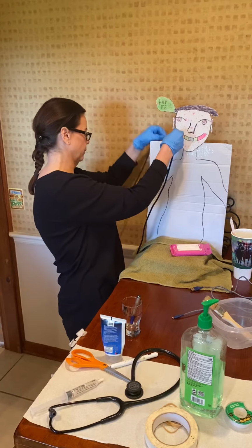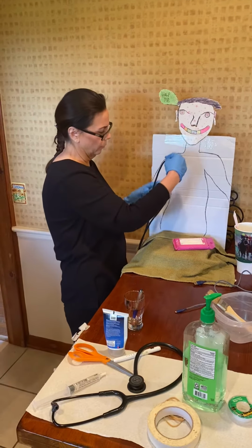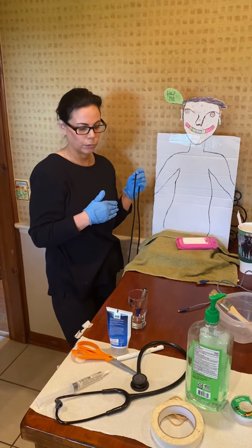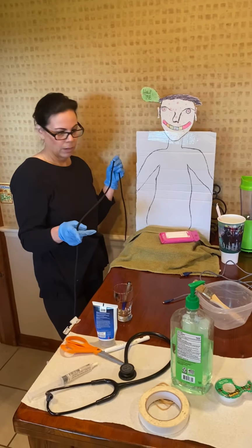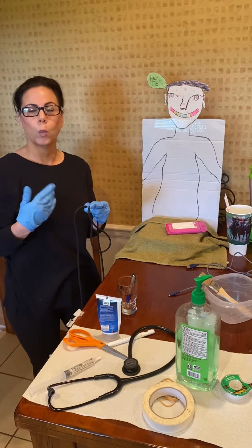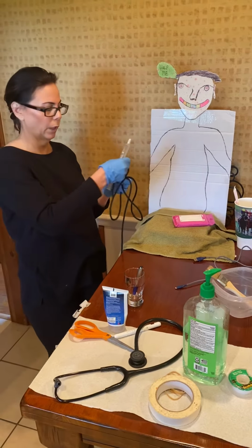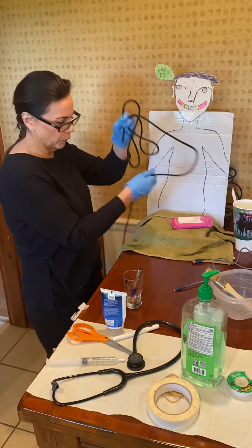Good. Okay, great. So it's down to where it was taped, the xiphoid process. We're going to verify the correct placement, but before we do that, we are going to aspirate the contents to check the pH and to check what the fluid looks like. So I'm going to take my little syringe. I'm at the end here. Let's pretend we're at the end. I'm going to aspirate, put it into here, and then we are going to look at it.